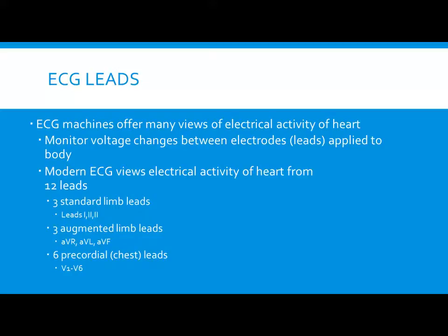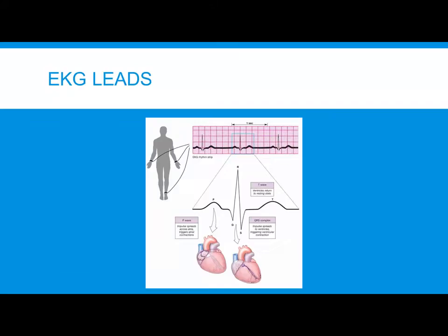Now, on down the line, we'll get into 12-lead interpretation, and I'll show you what to look for to make you move leads to say, hey, I've got a right-sided infarct or something with the right side. But for now, while we're learning the basics, you've got your 3 standard limb leads, you've got your 3 augmented limb leads, and you've got your 6 precordial chest leads. Okay?